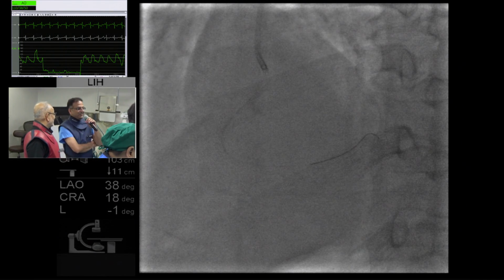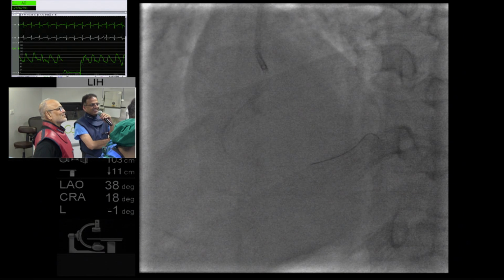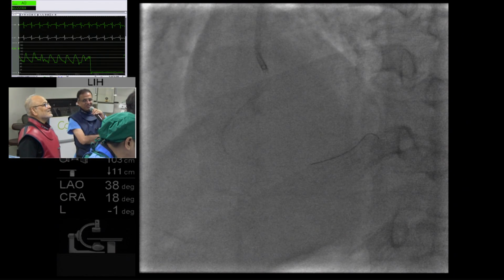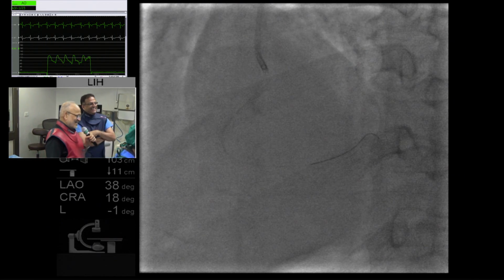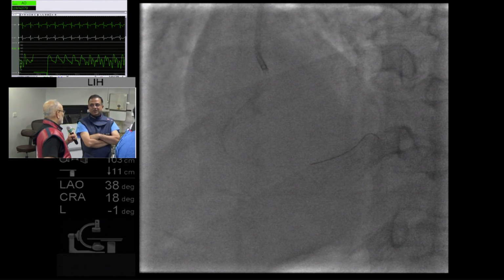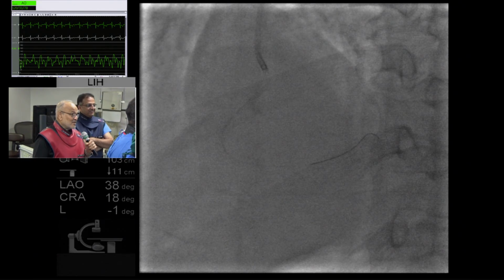So, talking to, my interest is physics. Even though I am a cardiologist, I love physics more than cardiology. And talking to metallurgists, platinum chromium is physically stronger than cobalt chromium. But it feels the same in the cath lab. I personally feel that whenever you want radial strength, I will go for cobalt chromium, and for trackability or conformability, I will think of this.